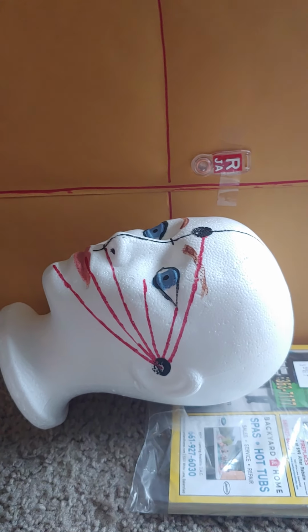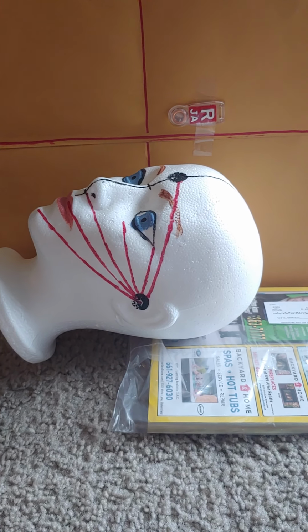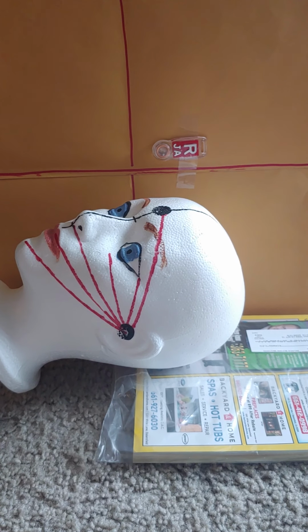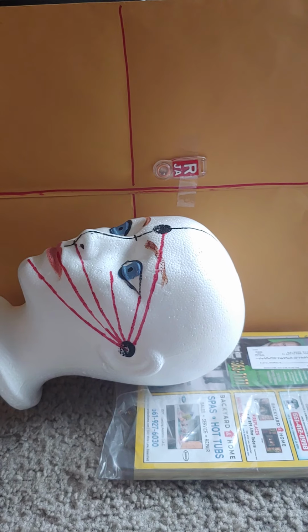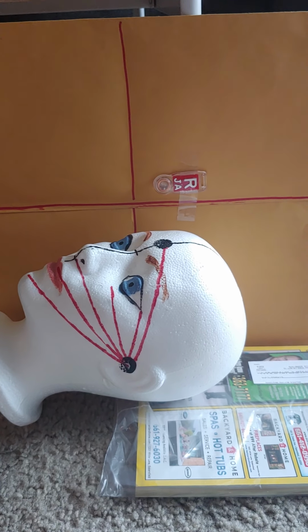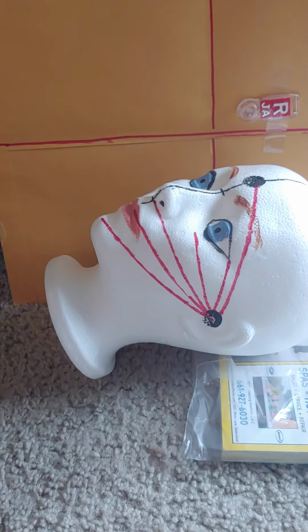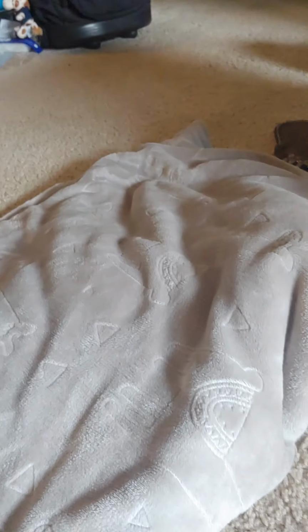For this projection, the evaluation criteria is you want no rotation, which is indicated by the greater sphenoid wings symmetric on each other, and no tilt with the orbital plates superimposed. I have a right marker indicating that the patient's right side was the closest one to the IR, and my patient is still shielded.